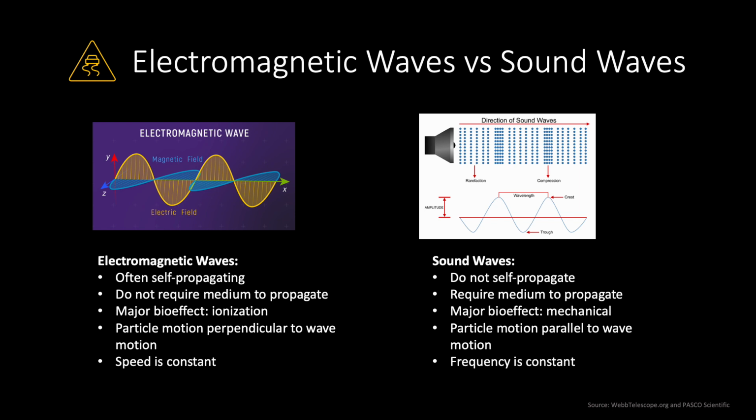Sound waves, however, do not self-propagate. They require a medium, and eventually, because they have to travel through a medium that imparts forces onto the sound wave itself, you're going to lose energy through the process of its transfer. So sound waves will not continue forever. Eventually, they will be turned into heat and be absorbed. The major bioeffect from sound waves entering the body is mechanical, heat generation. And so that's important to think about when we use high frequency, lots of energy waves in the body. We are imparting heat. We need to be aware.